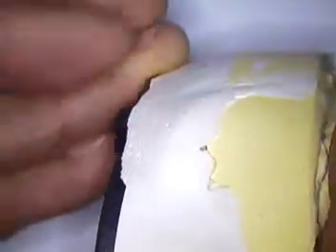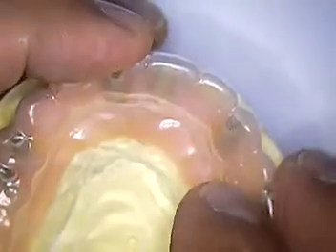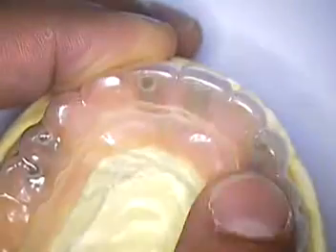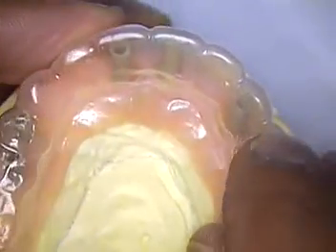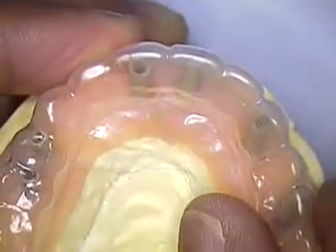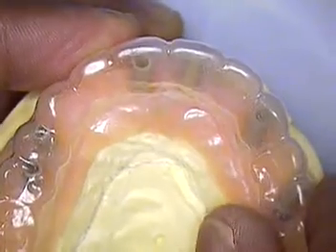This model has been mounted to a Dinar combi articulator, and so when we fabricate the temporary bridge or the scanning bridge, we'll be able to check the occlusion, the bite, and then move forward from there.